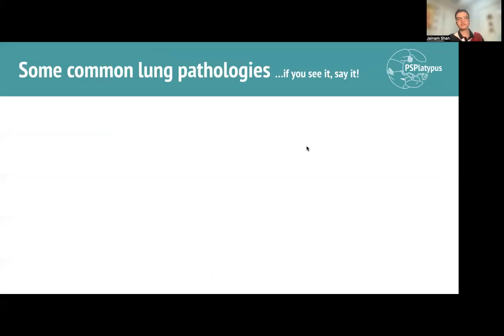Now, of course, when it comes to actually analyzing a chest X-ray, whether you've seen it in TV shows or in real life, most people wouldn't go through the entire A to I approach, right? Because if you see something, you'll probably name it first, if it's really, really obvious. But the previous approach is more so if you absolutely have no idea and you just want to tick off everything on the checklist. Sometimes you never know. You might actually be looking at a normal chest X-ray, right? So you want to be really careful.